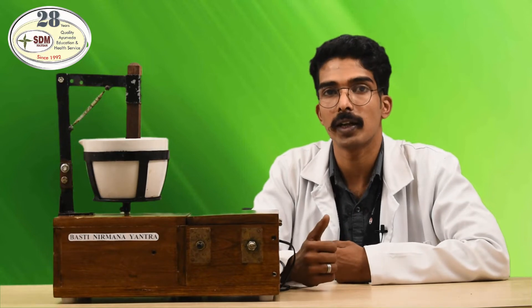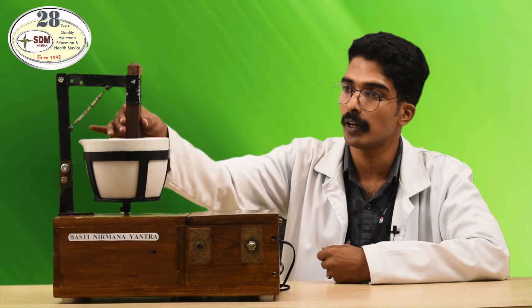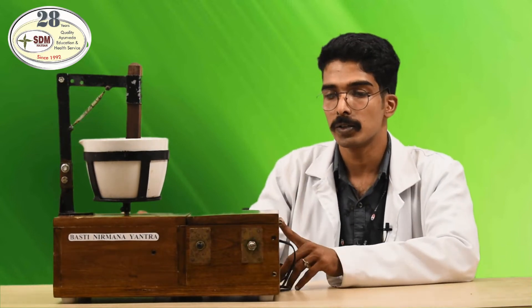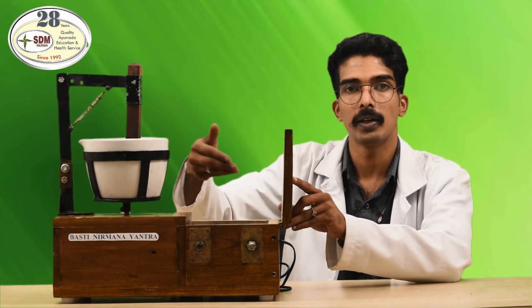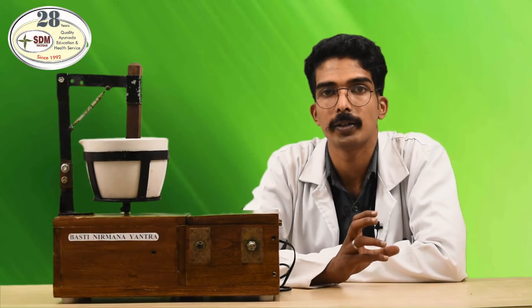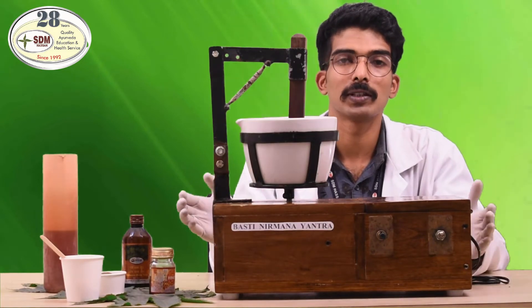The Bhasti Samyoga and Manthana action will happen on this instrument. You can see there is a khacha and a khalwa held with a holder and the khacha holder. This instrument is capable of working on both current and battery. You can see the button — here the electrical and motor components are maintained separately. It has two RPM speeds: one for the mixing of honey and saindava, and the other for the khalwa. We are going to demonstrate how to make Bhasti through this Bhasti Nirmana Yantra.